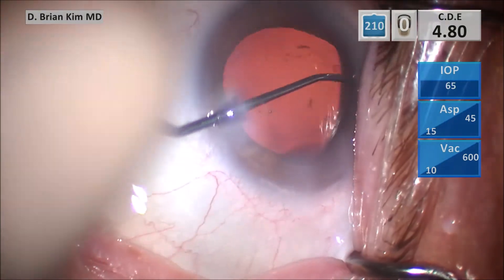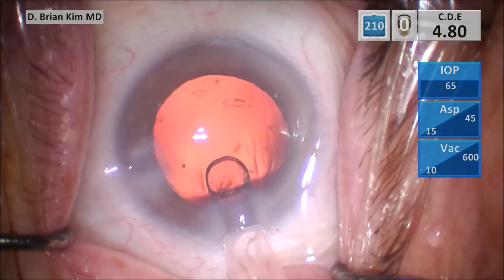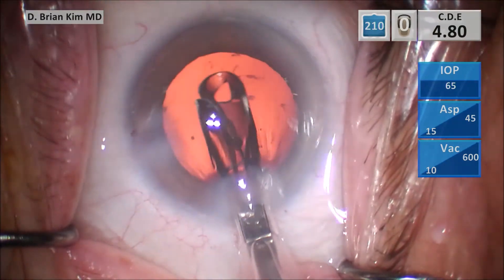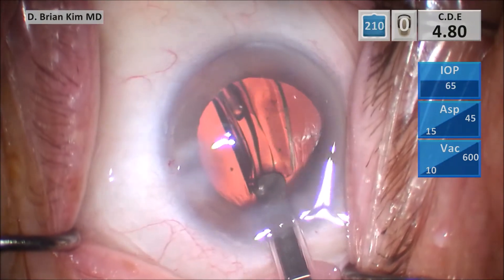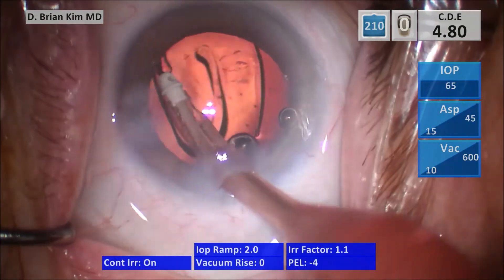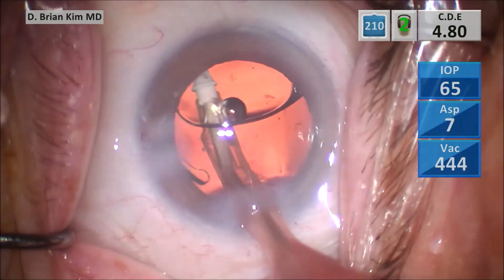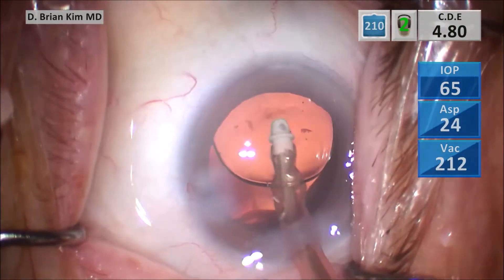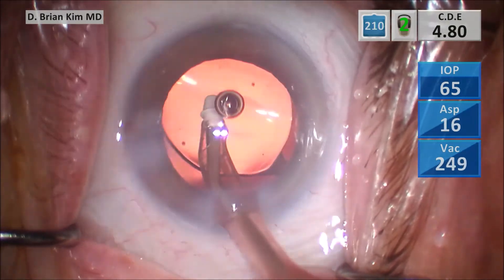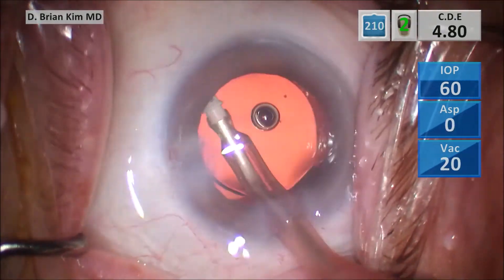Thankfully, I'm still able to see without much difficulty, even though I am literally working in a pool of water. Going in with a single piece acrylic lens into the capsular bag. I go in with irrigation off, activate irrigation, making sure the haptics are off the optic, tilting the optic, rotating 90 degrees clockwise, making sure I remove all the viscoelastic from within the bag, ensuring that both haptics are still within the bag, and polishing underneath the rhexis edge to remove any potential lens epithelial cells.